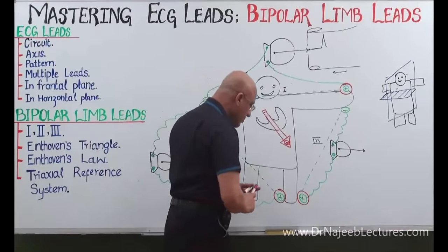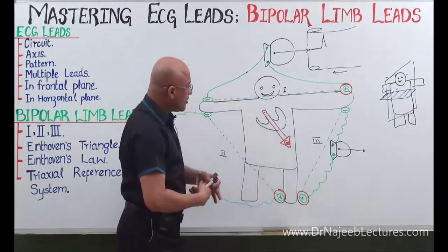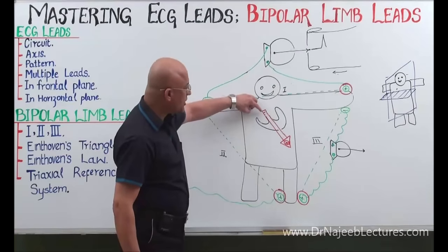Now, this vector is moving in the frontal plane. It is moving downward and leftward.